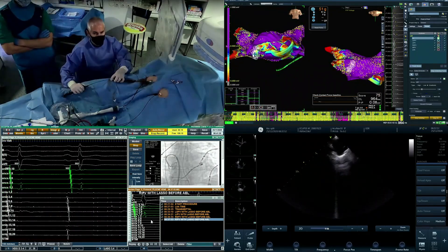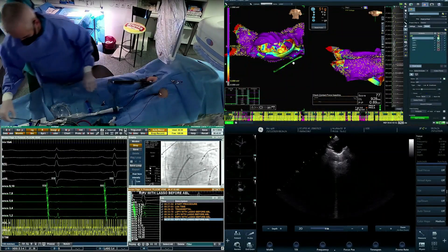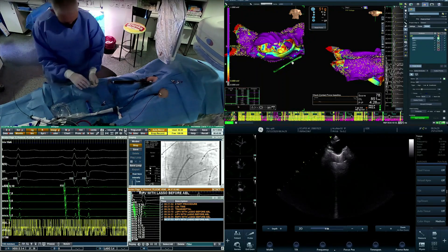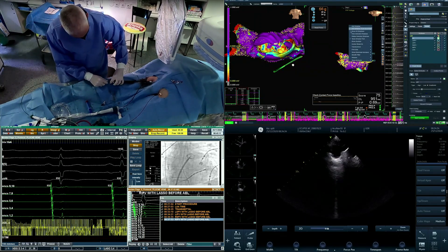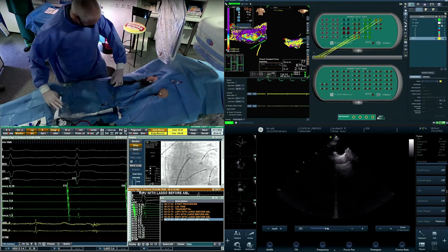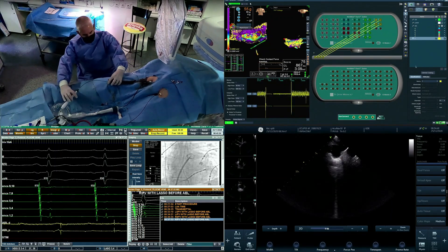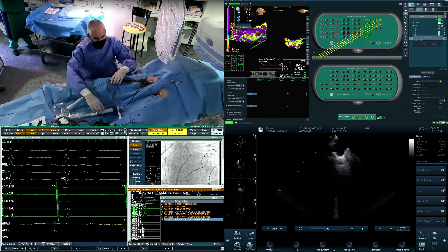Since we are using the impedance principle here to acquire the map, we're going to refine our map by introducing the magnetic sensor-enabled ablation catheter. In this case it is a TactiCath sensor-enabled, contact force sensing catheter. By investing a couple more minutes to improve the accuracy and stability of the map, we are putting ourselves in position to have a smooth workflow later in the procedure.